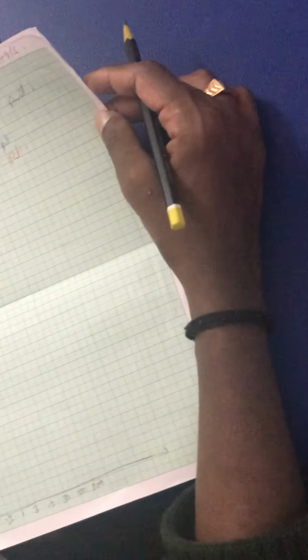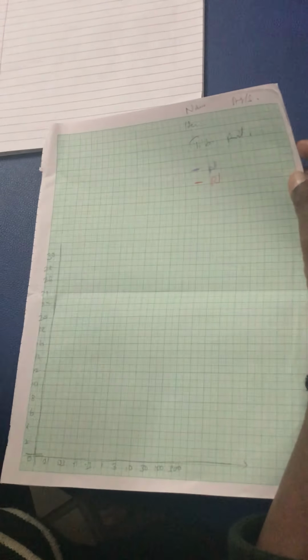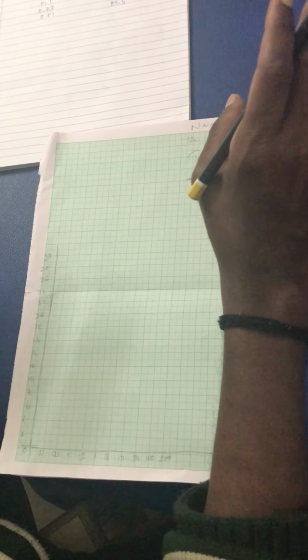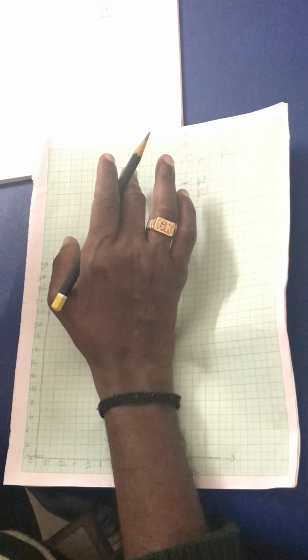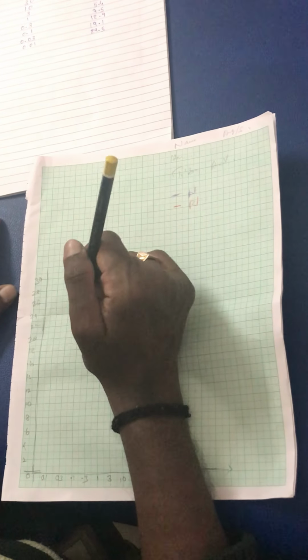Because there is that machine, there is no need to do all these things. You just choose the duration and choose the intensity. Once you are satisfied with that intensity, you shift to the next duration, and the next, and once you say the test is over, it will plot a graph on its own on the screen. You can save it with the date.